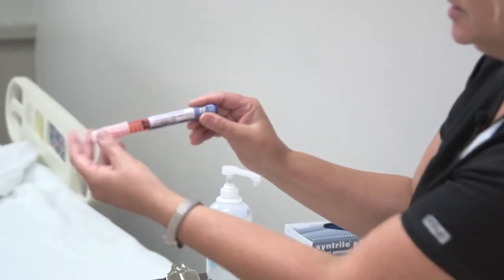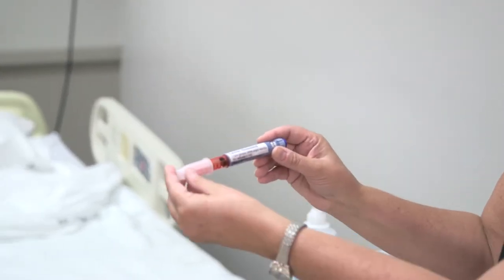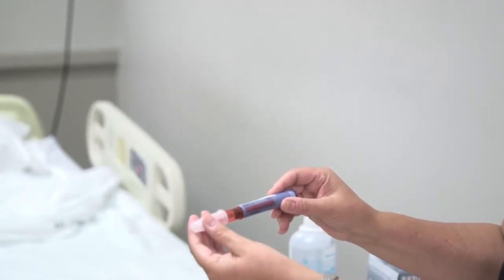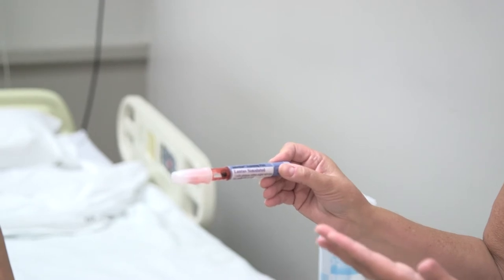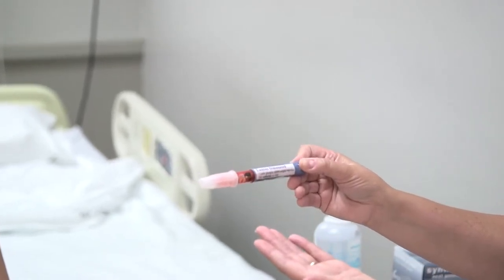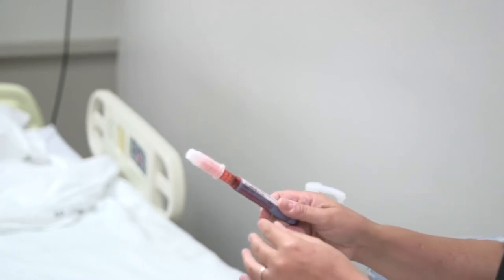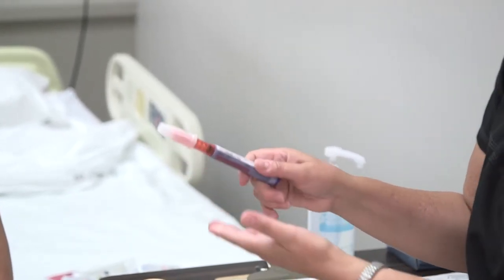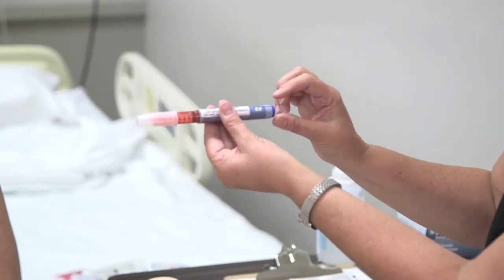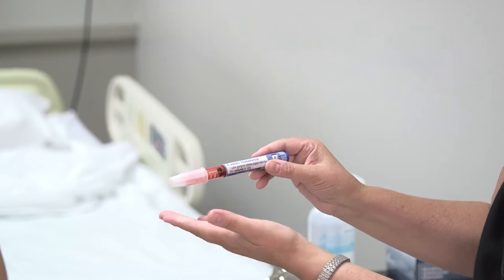I'm going to demonstrate an insulin pen injection. Insulin pens are pre-filled with insulin and come in all different types. This one happens to be Lantis, but you'll see them in a variety of insulin types. The difference with a pen is that you don't have to draw anything up — you simply dial the units you want.